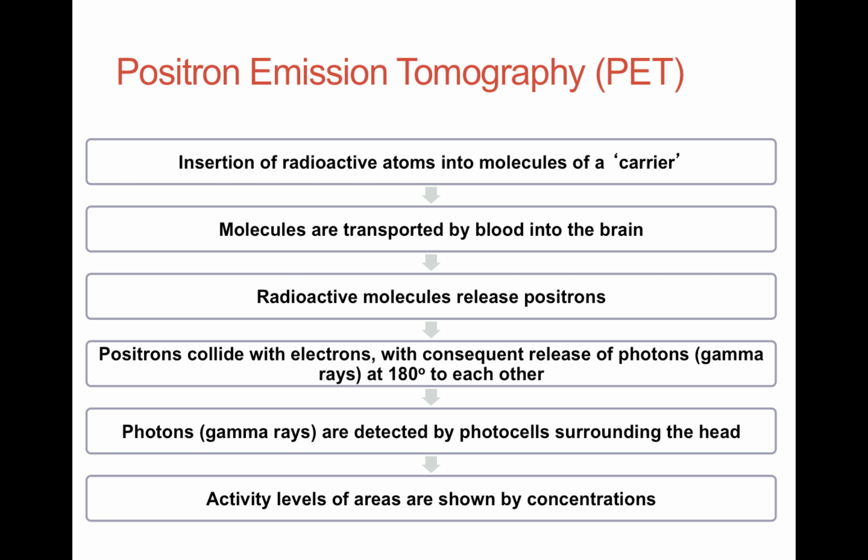during its metabolic process. For example, in PET scans of the brain, a radioactive atom is applied to glucose, which is blood sugar, to create a radionuclide called fluorodeoxyglucose, or FDG. Because the brain uses glucose for its metabolism, FDG is widely used in PET scanning.